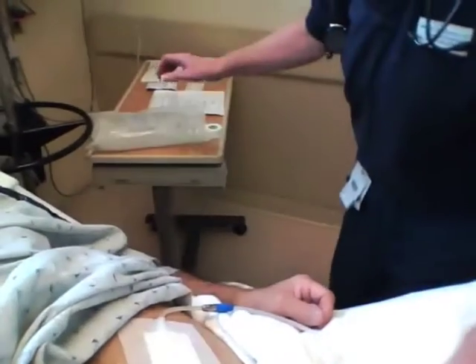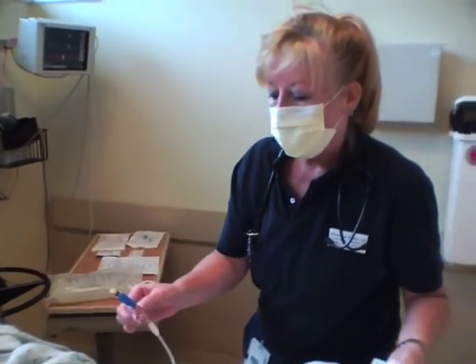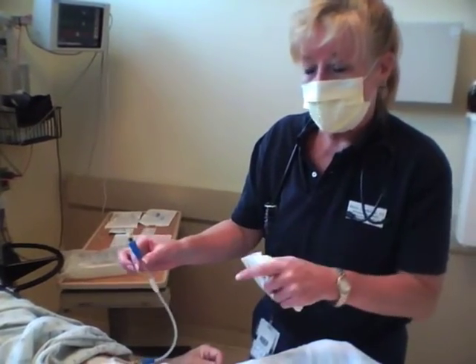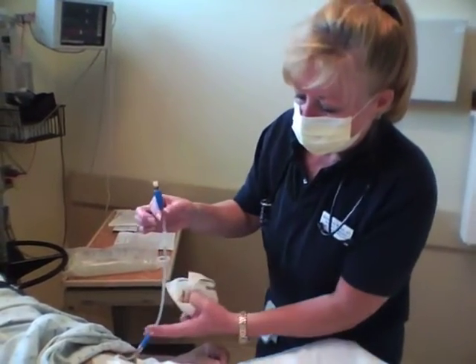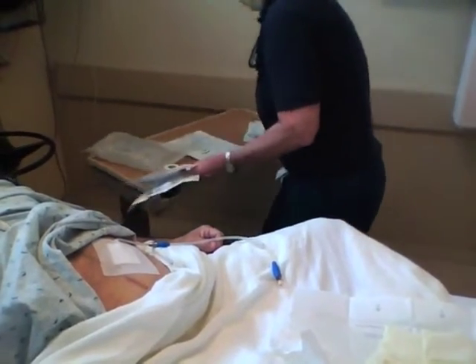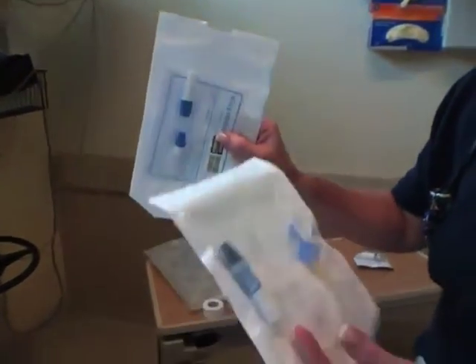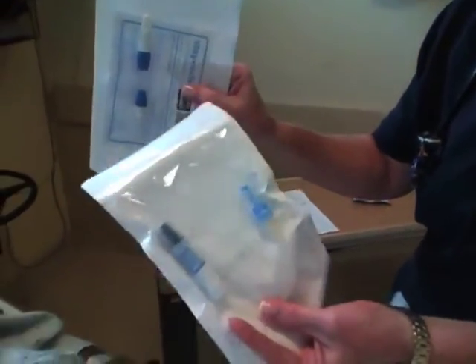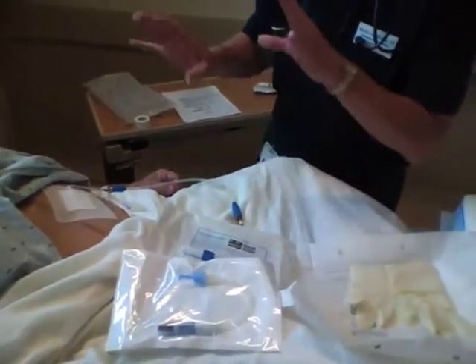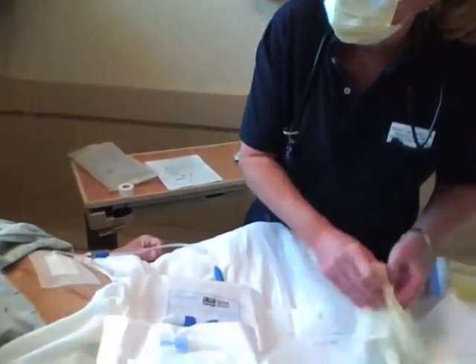So what we're going to do is put an adapter on here so that we can use the equipment that we have in the hospital. The equipment we have in the hospital is Baxter, and again, this disposable piece here is Fresenius. This is the Fresenius adapter that goes on to our Baxter equipment. Sounds crazy, but eventually when they get all the contracts figured out, we won't have to do this, but right now we do.